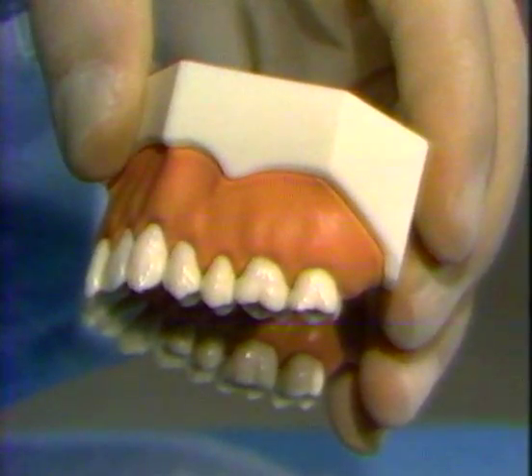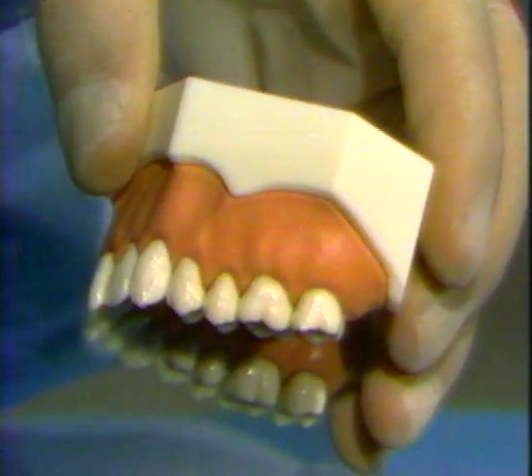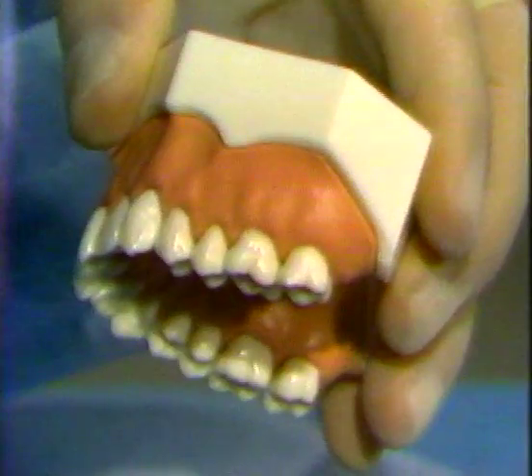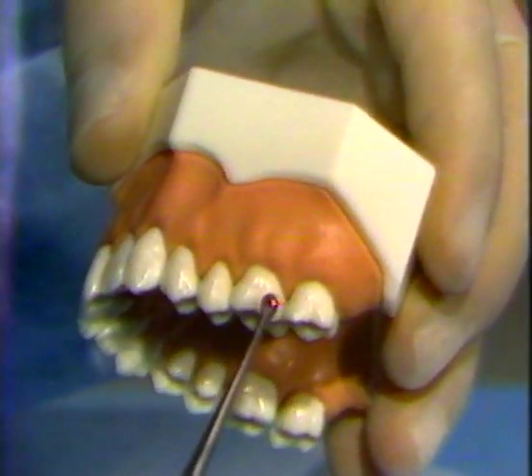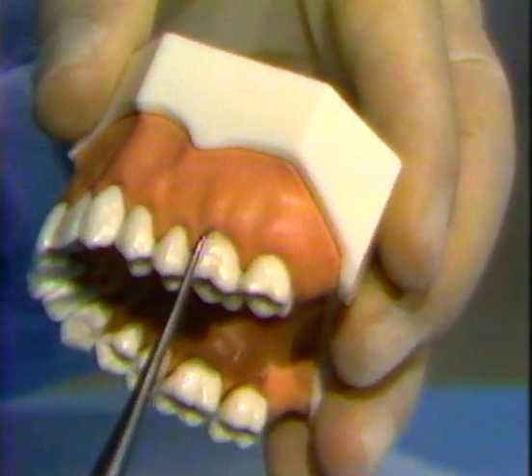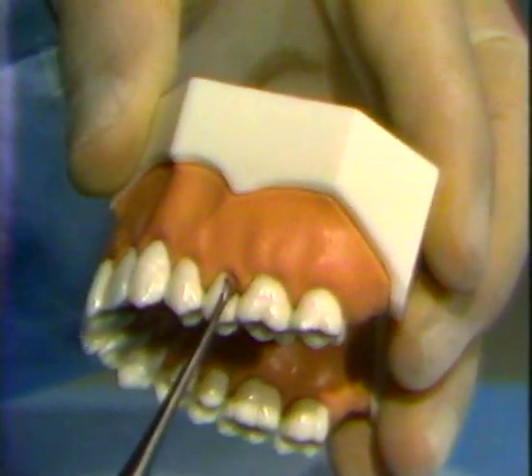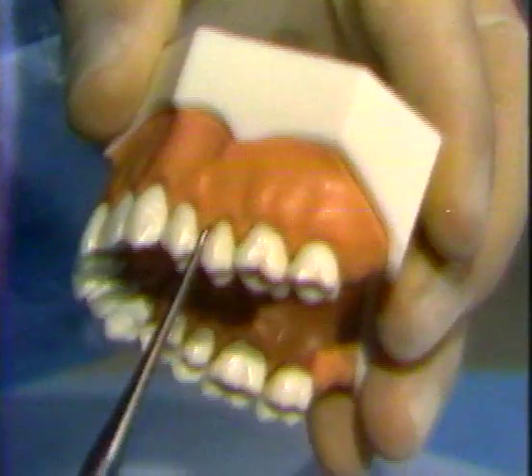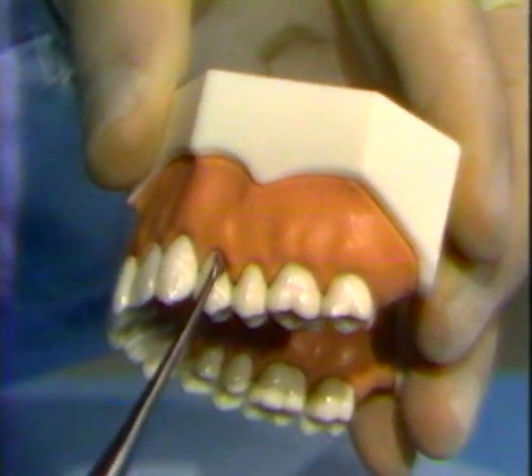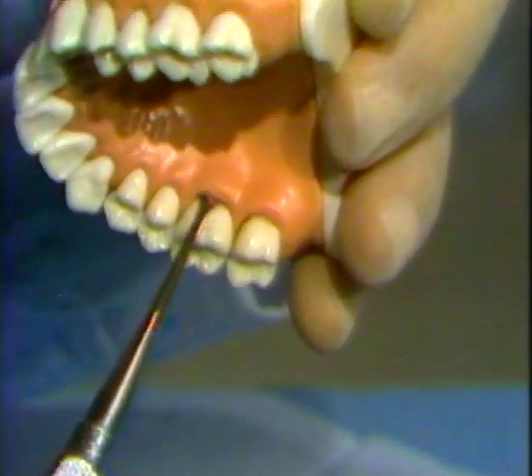A sharp number 2 Molt Curette is first used to check the depth of anesthesia. When the anesthesia is profound enough, the curette is slid around the crown of the tooth inside the free gingival cuff in order to sever the gingival attachment of each tooth to be extracted in that quadrant. This is done first on the buccal or labial surface and then on the lingual or palatal surface.